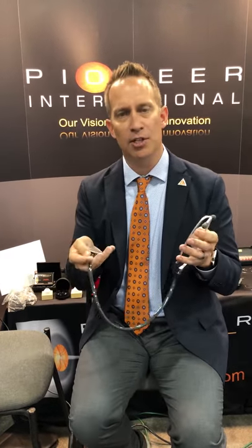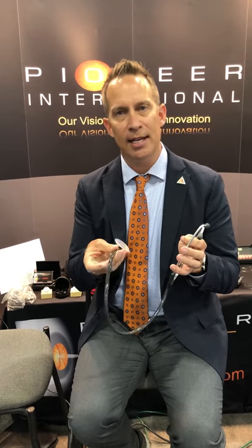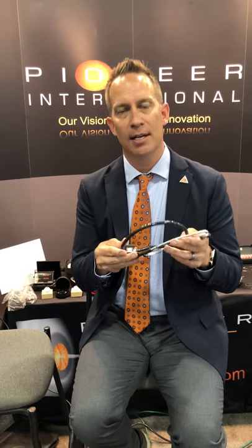Our 3.2 stethoscope is latex free and offers great sound transmission, and the combination is a really great combination kit for your practice.